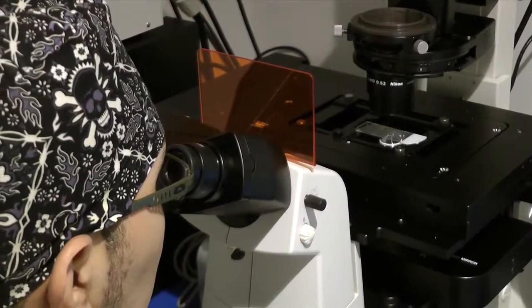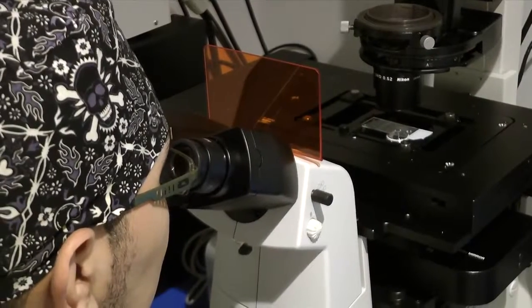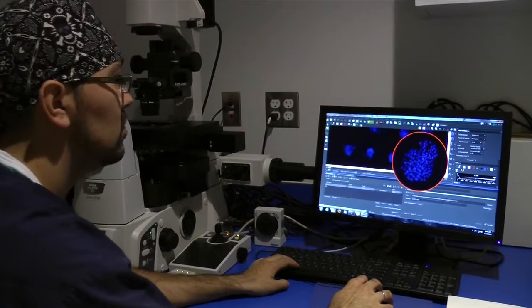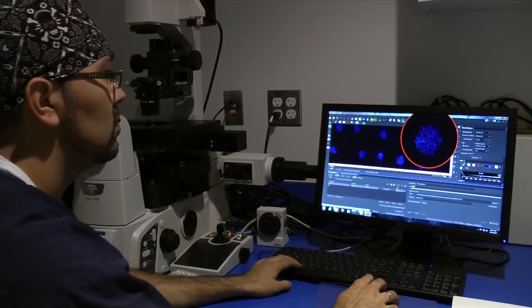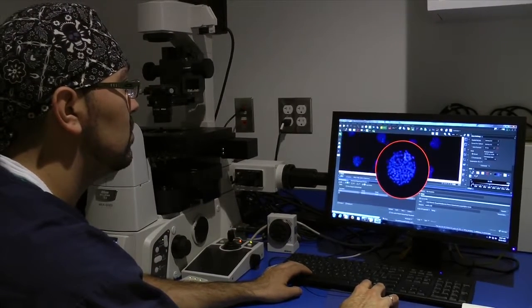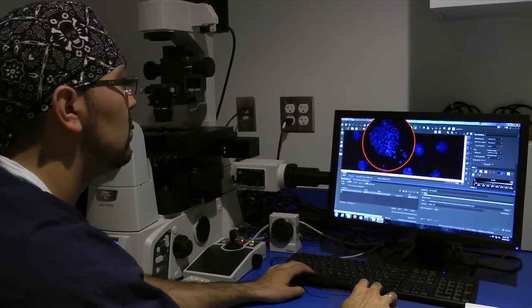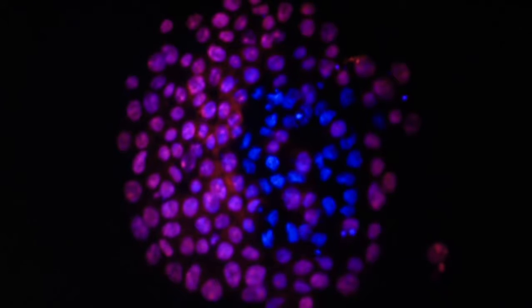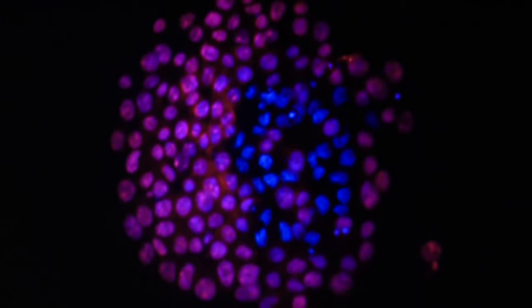And what we see in our laboratory is that morphologically we may have embryos that look very similar, but using a technique of cell staining, we can go inside the embryo and actually determine the viability by counting the number of cells that are present. We can do this by doing a total cell count, or how many cells make up the inner cell mass and the trophectoderm. And for specific raw materials that may be more sensitive or more variable, we can use a dual stain or differentially stain the embryos, looking specifically at the trophectoderm cells and the inner cell mass cells.